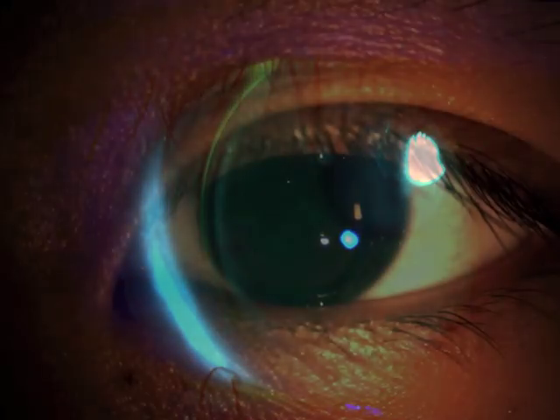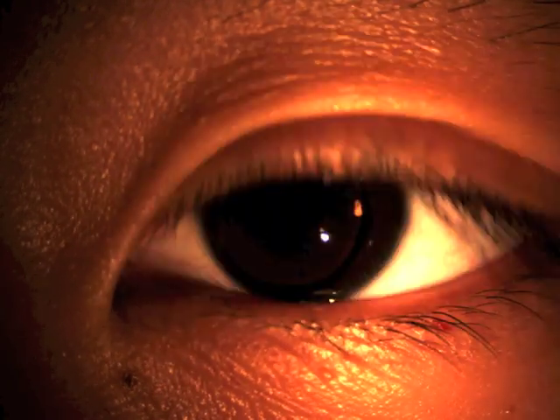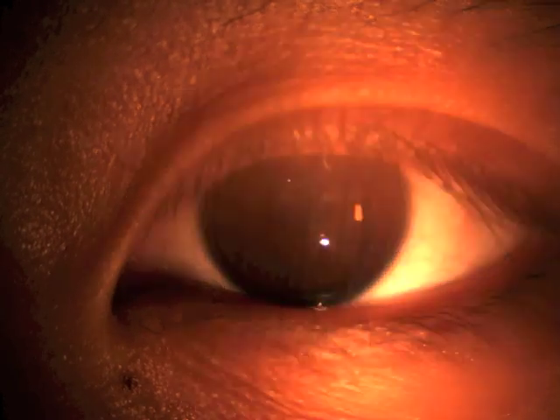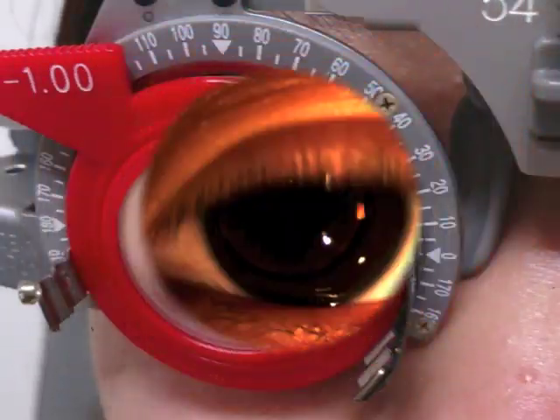For a steep-fit RGP lens, you'll observe central pooling with peripheral bearing, meaning that the lens is actually touching the cornea on the periphery without any fluorescein. Edge clearance-wise, for a steep-fit RGP, you'll observe about 0.3 to 0.5mm of edge clearance. Sometimes it may not be even all around, depending on individual fit. Movement-wise, for a steep fit, you may observe about 1 to 1.5mm of vertical movement.